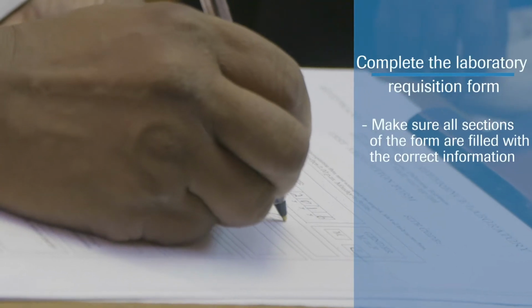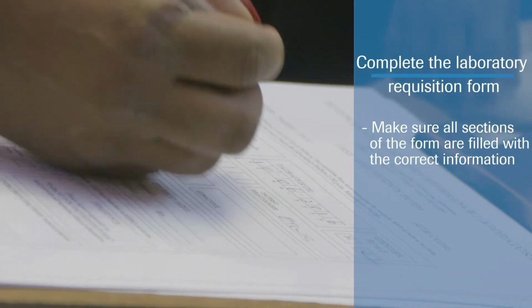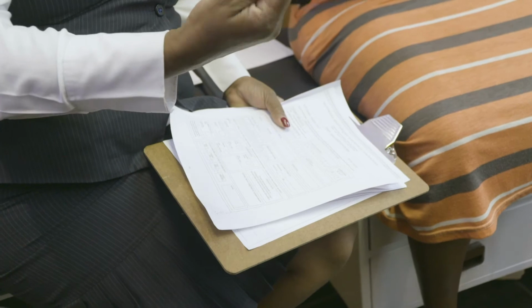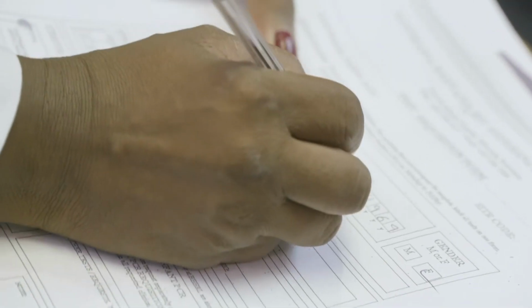Use a pen to complete the laboratory requisition form as per instructions in the National Guidelines for HIV diagnostics. If the information is not complete and correct, the lab may reject the DBS. This is a very important step to ensure that the test will be run and the results can be returned. Make sure that your handwriting is clear and legible.